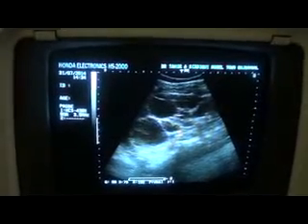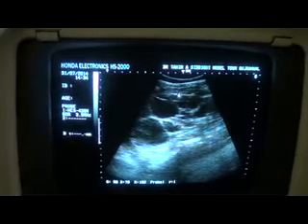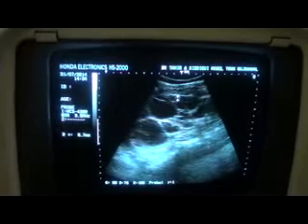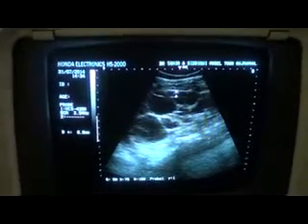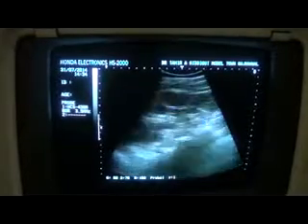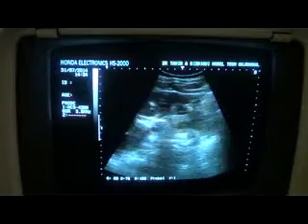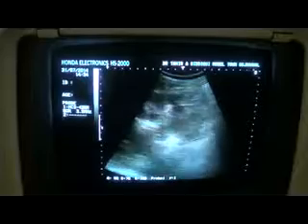however in fact with thinned out parenchyma. This is the total of the parenchyma that is visualized. This is the anterior mid-region parenchyma. This parenchyma measures 6.8 in the anterior mid-region. So the parenchyma is thinned out. So the corticomedullary differentiation is muffled in this right kidney.